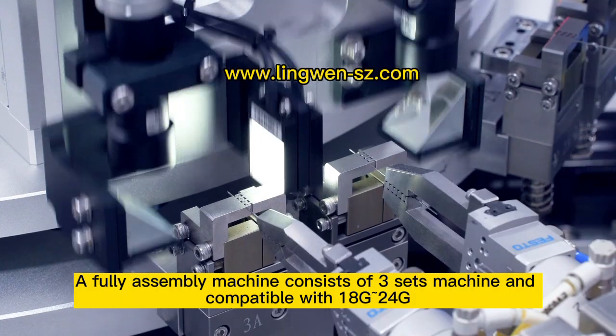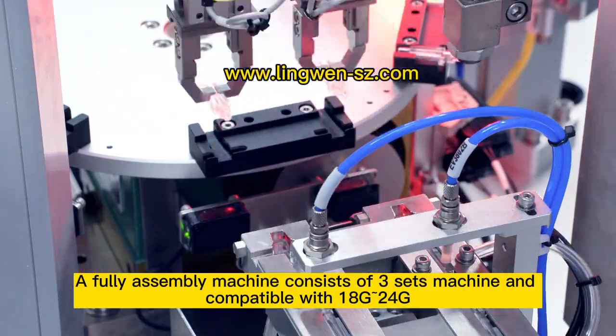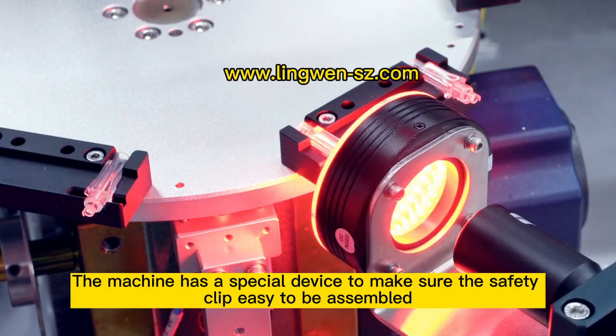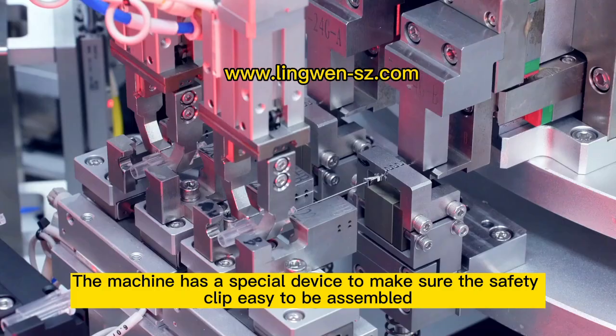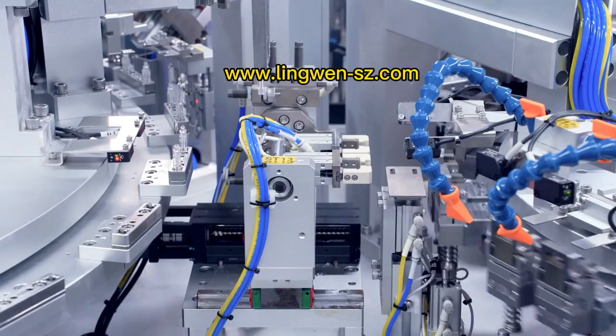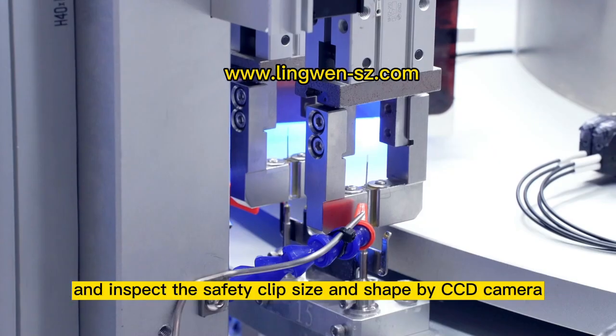A fully assembly machine consists of 3 sets machine and is compatible with 18G to 24G. The machine has a special device to make sure the safety clip is easy to be assembled, and inspects the safety clip size and shape by a CCD camera.